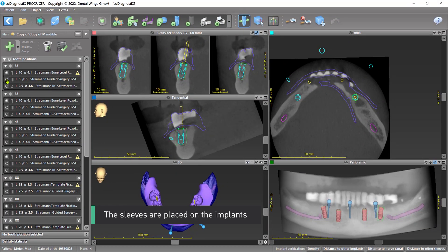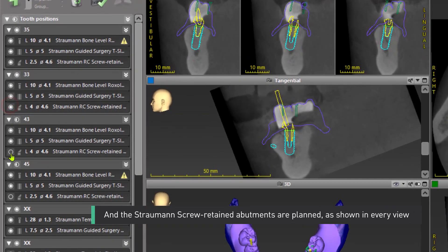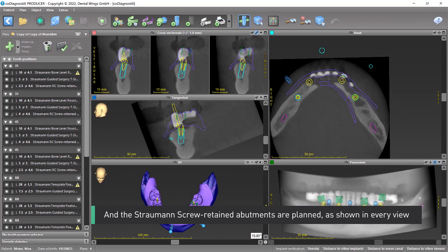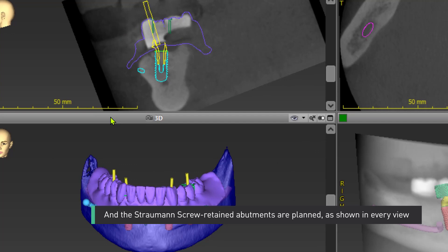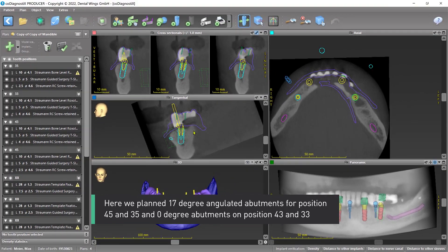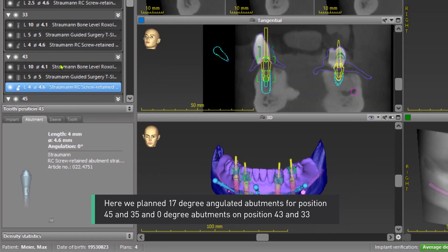The sleeves are placed on the implants and the Straumann screw-retained abutments are planned as shown in every view. We planned 17-degree angulated abutments for positions 45 and 35, and 0-degree abutments on positions 43 and 33.